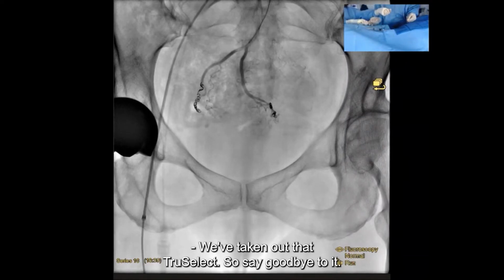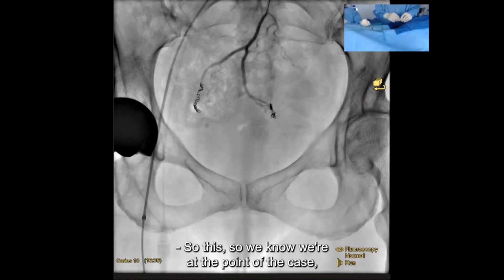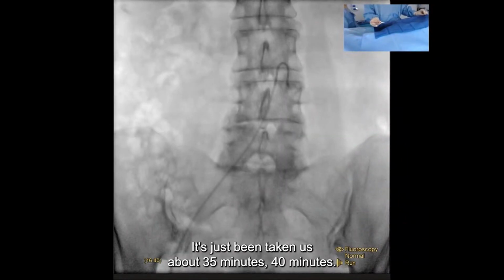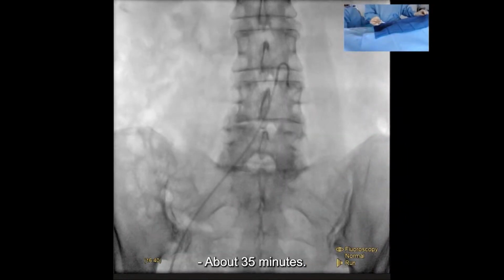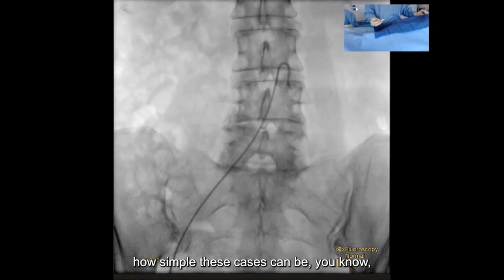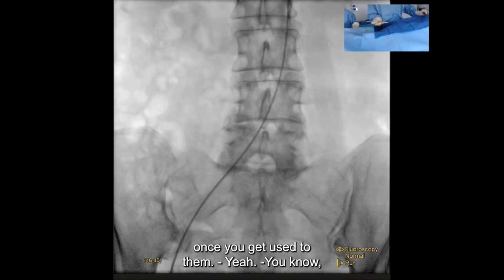Right. I'm taking out that TruSelect, so say goodbye to it, Ari. So we're at the point of the case where you're taking out the catheter and closing up the artery. These cases are taking us about 35 to 40 minutes. Just to point out how simple these cases can be once you get used to them.